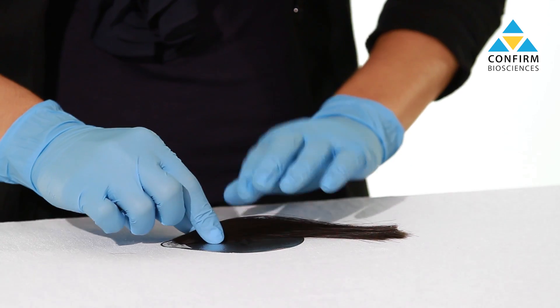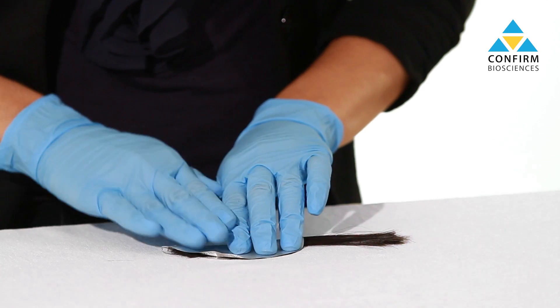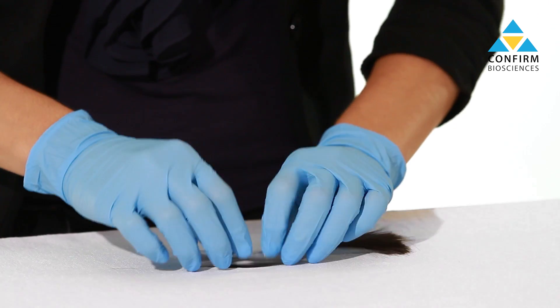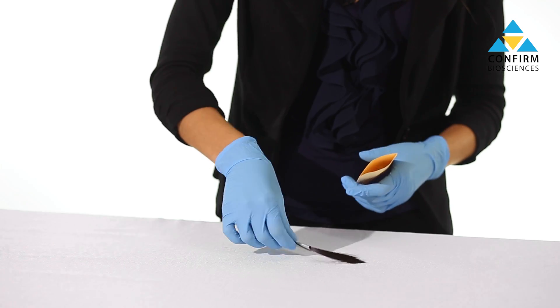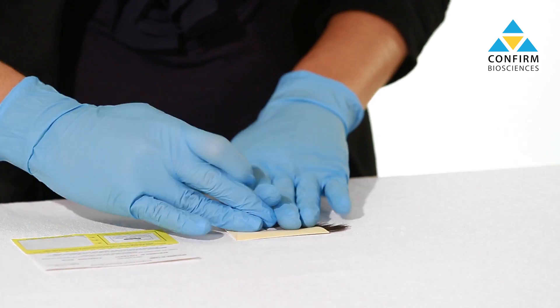Place the root end of the hair sample onto the indicated area of the collection foil, then fold the foil in half along the dotted line, then neatly fold it once more lengthwise. Place the collection foil into the hair specimen envelope and seal with the provided security label from the specimen ID card.